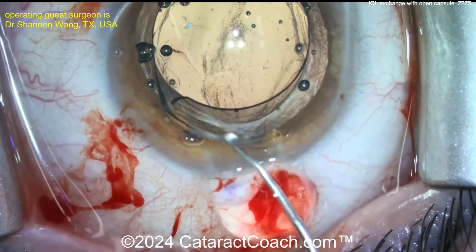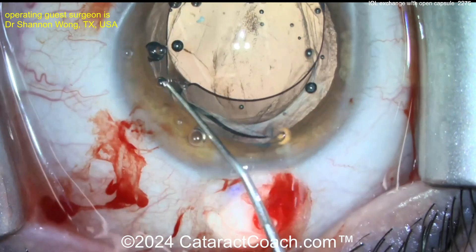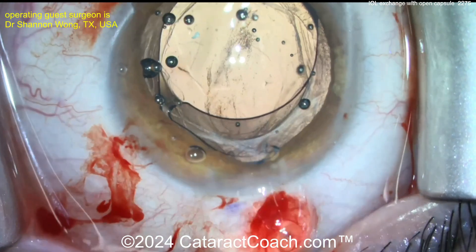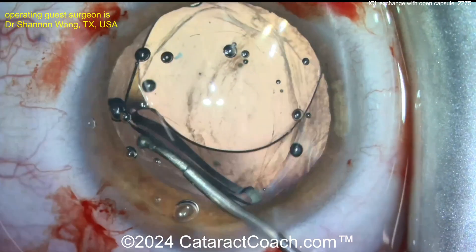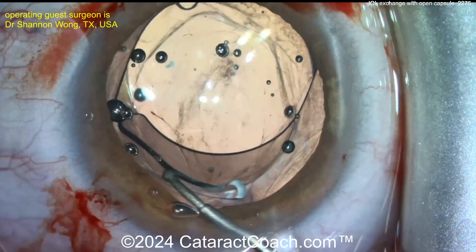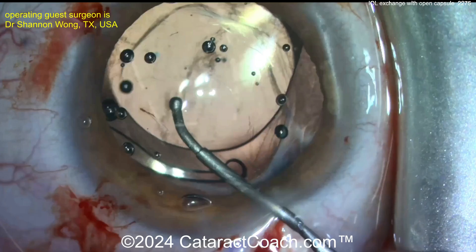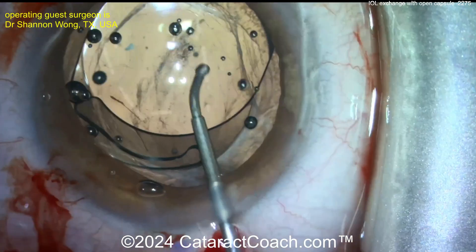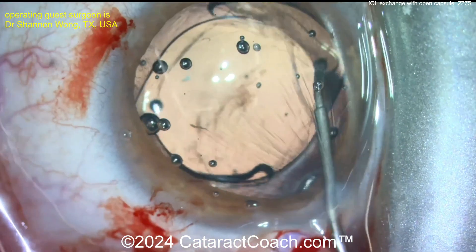As you do this, it's pretty normal for the posterior capsule to expand and open more. So if you have a small laser capsulotomy and think it'll be easy, as soon as you put some viscoelastic in you may notice that posterior capsule opening goes from small to quite large.